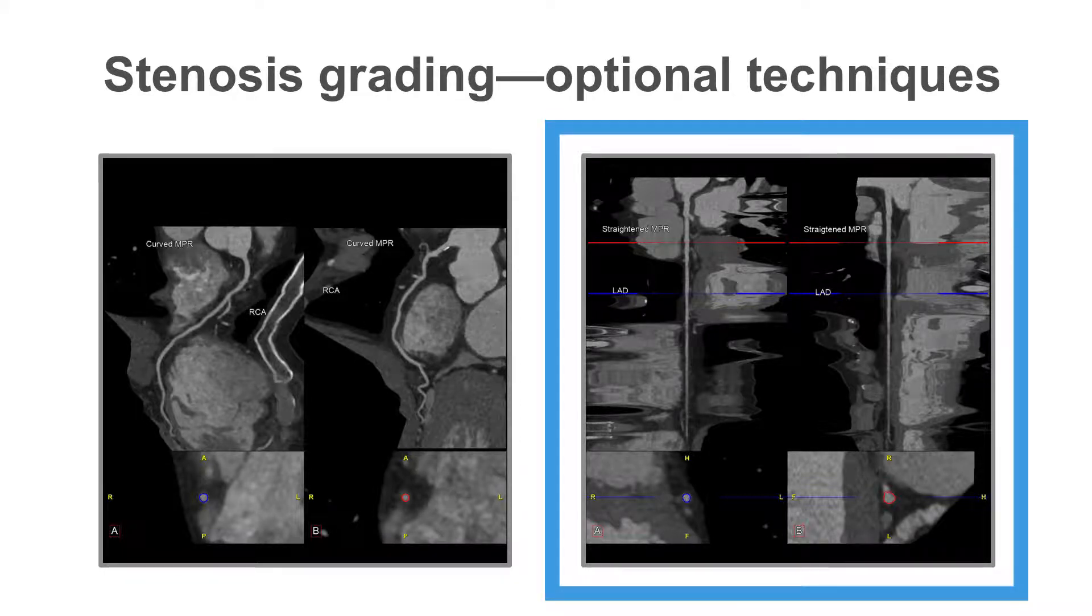The right hand image shows a variation of this, the so-called straightened multi-planar reformatted image where the vessel is laid out straight by the computer.